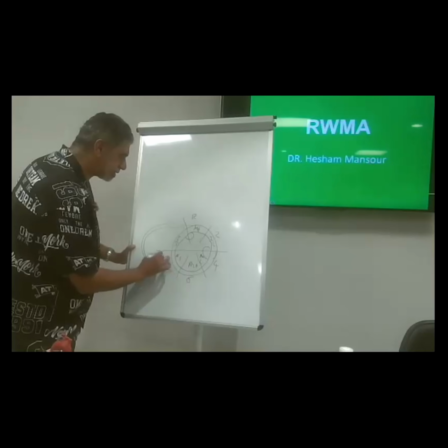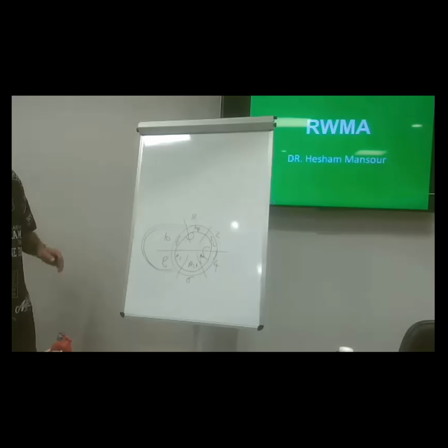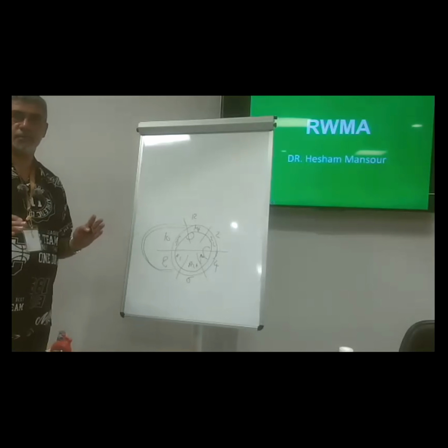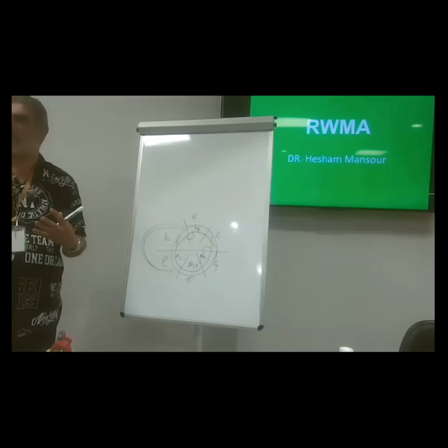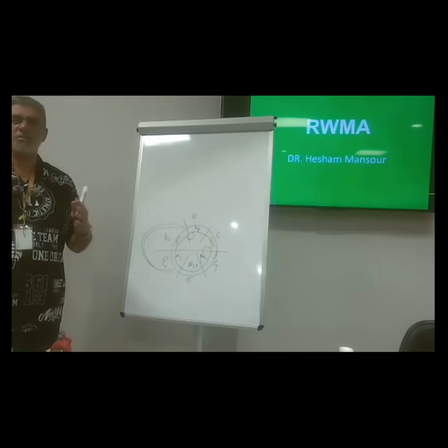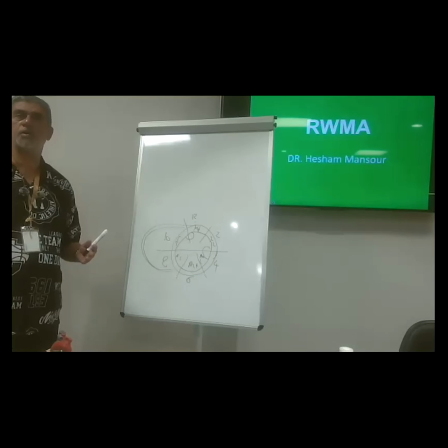This at 8 o'clock. This at 10 o'clock. Train yourself, this is a beginner, but don't be shy. No problem. The importance is to get the issue. By any means, I don't care, but get it in the right way.